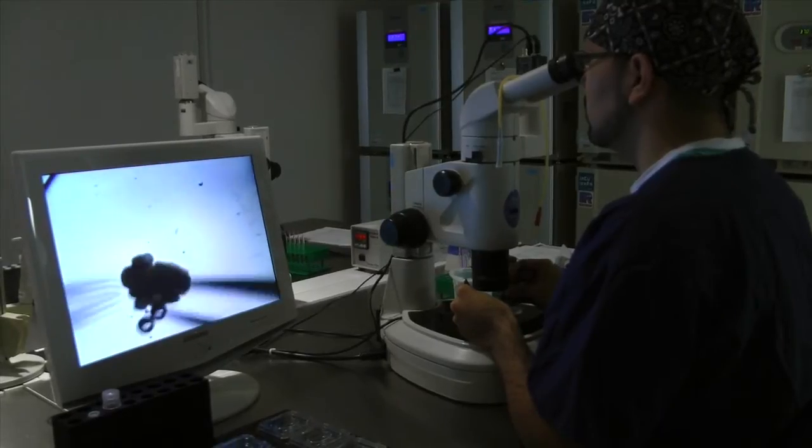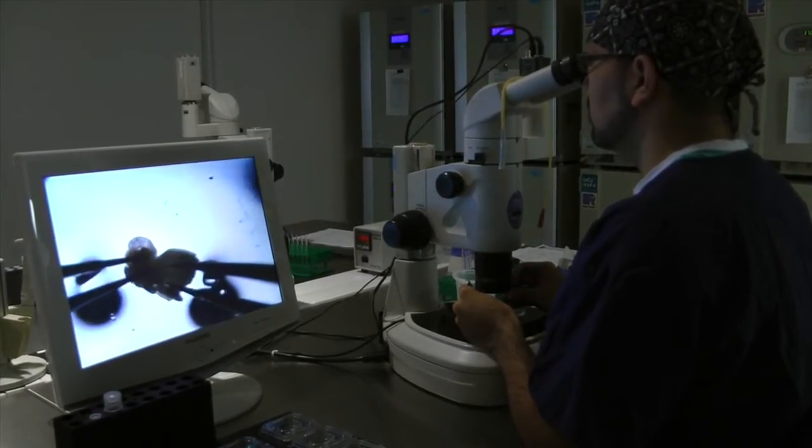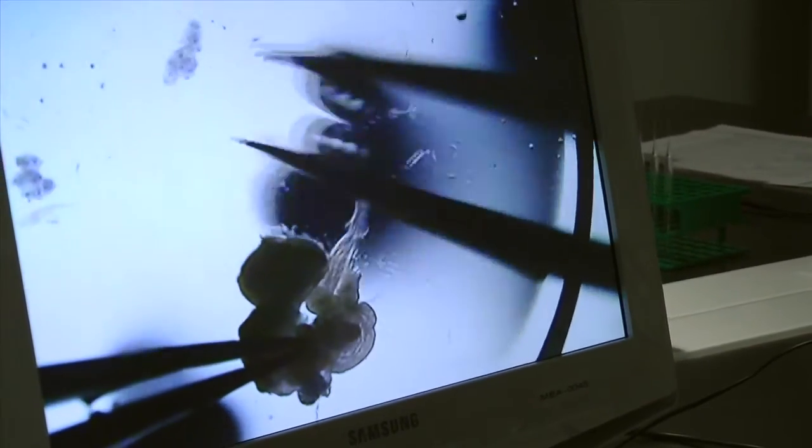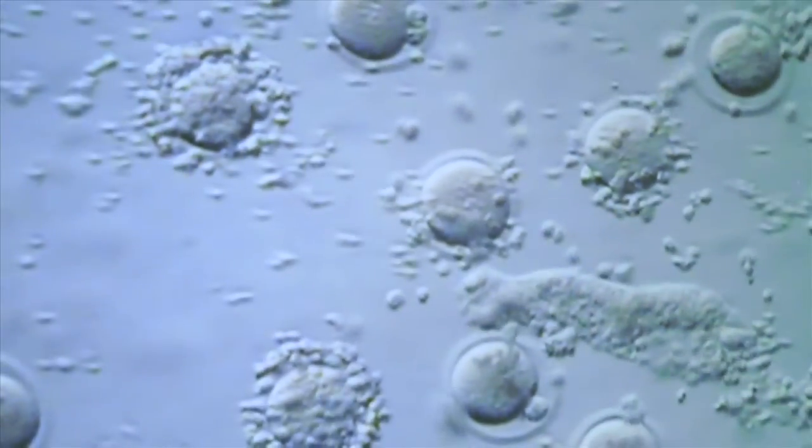MIA is a mouse embryo assay, and it's utilized to detect toxicity in compounds and to assist us in evaluating the quality of the media that's manufactured. For MIA, we use the one-cell mouse embryo, and we expose media or the mouse embryos themselves to the materials or the products that we're producing. The assay is a five-day assay that allows embryos to develop to the blastocyst stage, and then we can make qualitative and quantitative assessments on the quality and the toxicity present for the materials that are used.